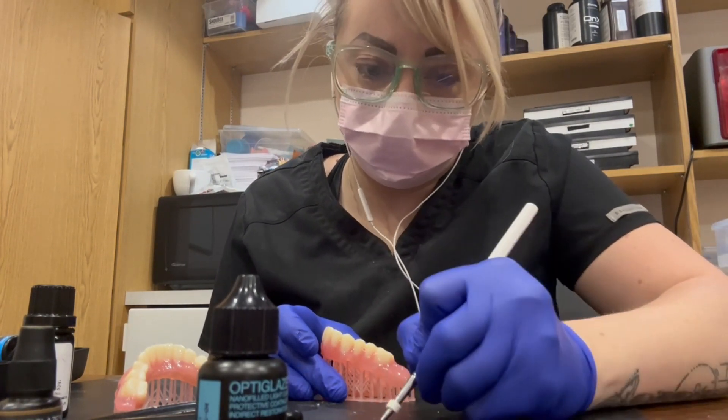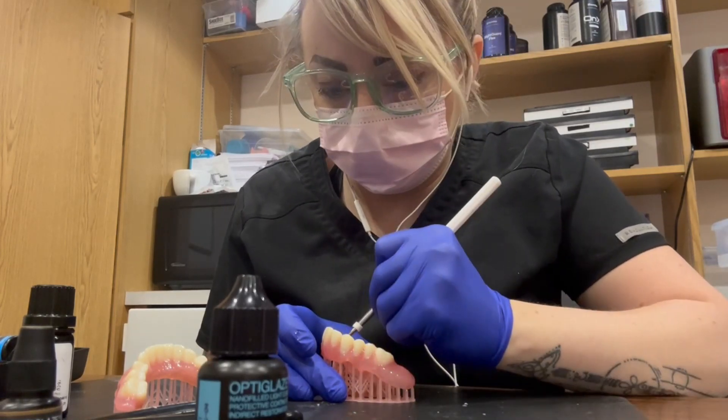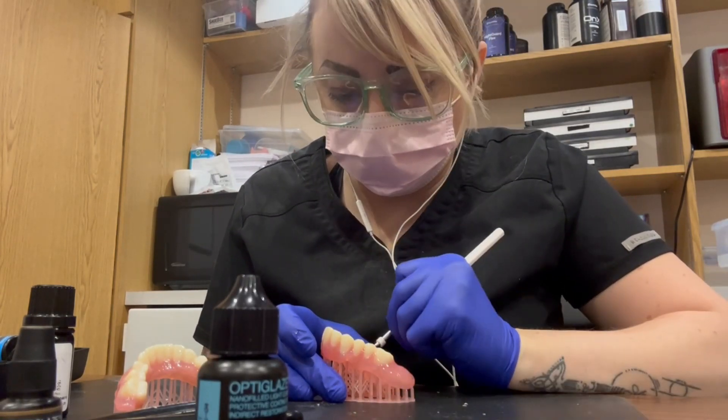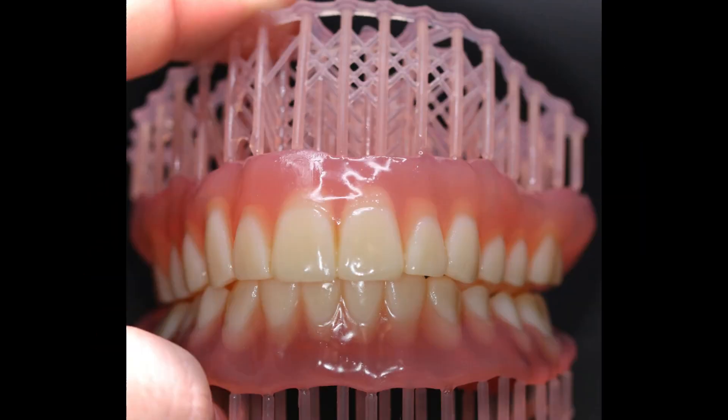They took just a couple hours of work with really great results. We loved getting to do it in-house — if anything happens we can reprint it. If the patient breaks it or if we need to reline it, we can even remake it from the scans. They do turn out really beautiful, give it a nice high shine. It's not exactly the same as acrylic dentures that we're used to, but it is a really great option and we just love them in our office.